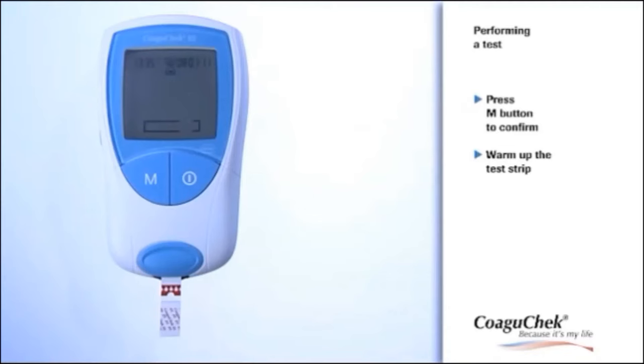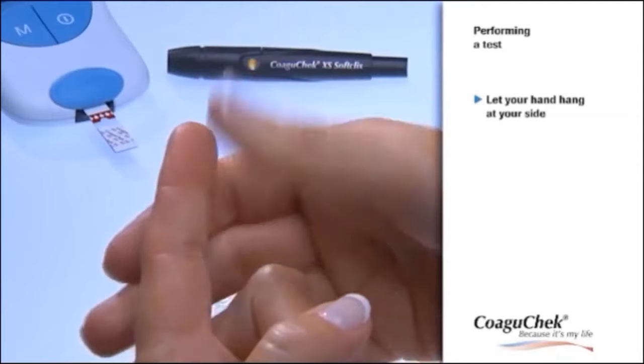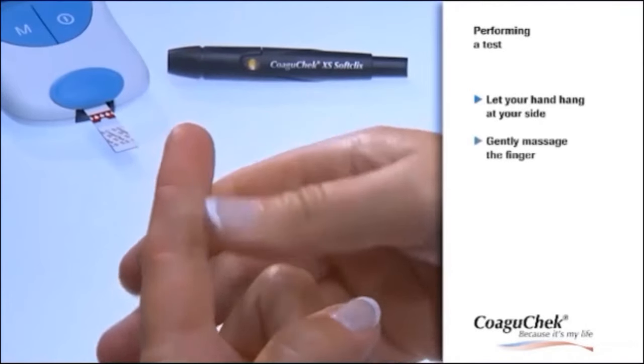The code number stops flashing and the test strip is warming up. This is the perfect time to start getting your blood sample. Before you start lancing, let your hand dangle for a moment and then gently massage the finger.